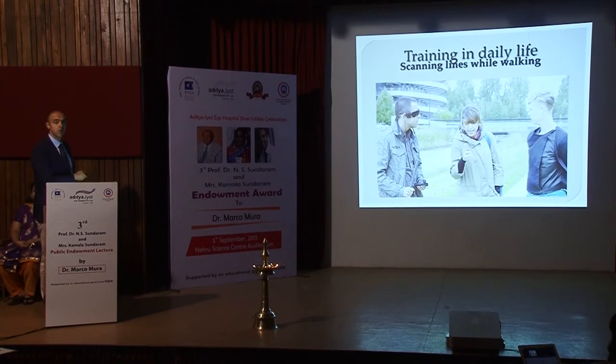What we usually tell these patients, who are used to going around with guide dogs, is that the dog senses when the patient starts seeing again. So what we usually suggest is that when they use the device, they should not use the dog.